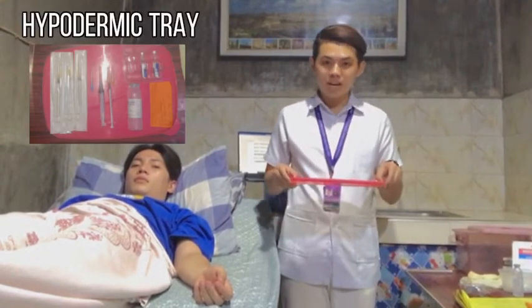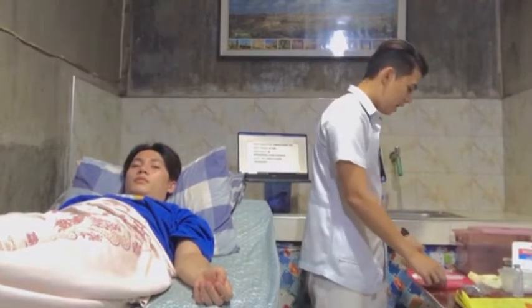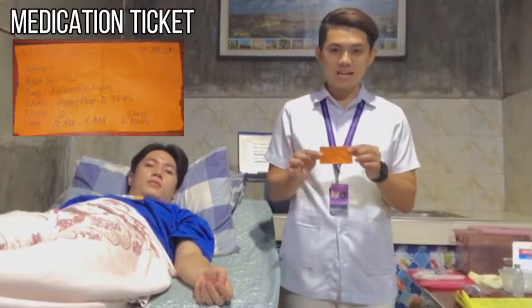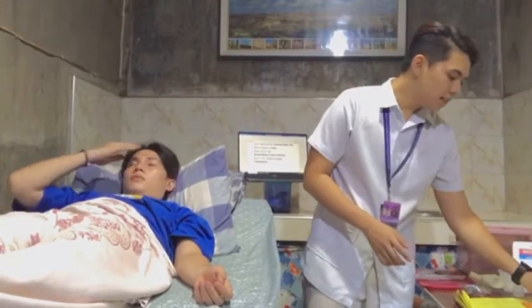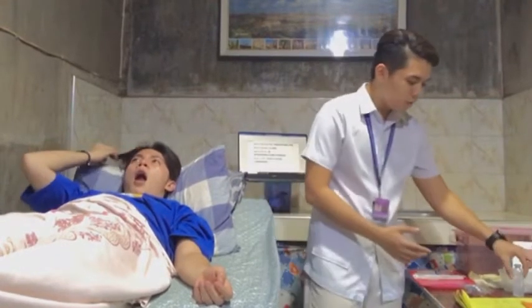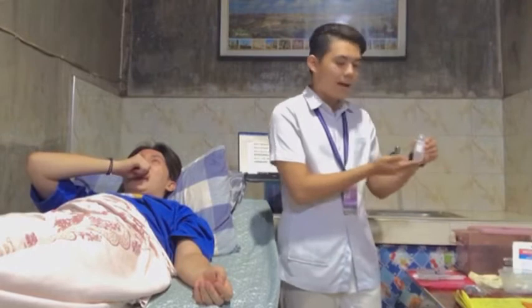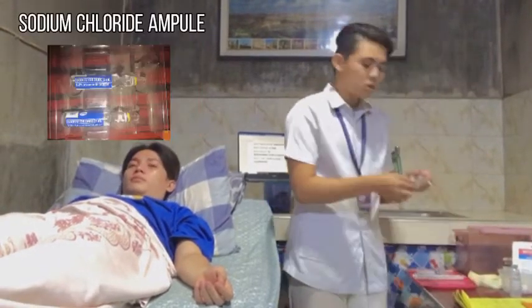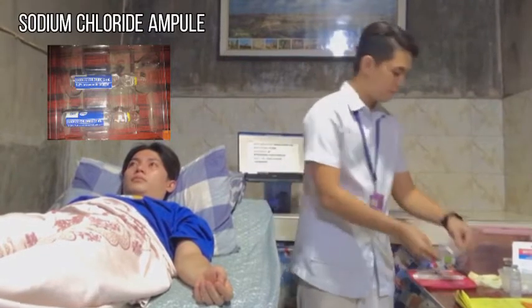hypodermic tray. And of course, we will be having the medication ticket. I have the orange one here. And of course, let's have our solution prescribed. So, it will be like the paracetamol vial and of course, the sodium chloride ampule.